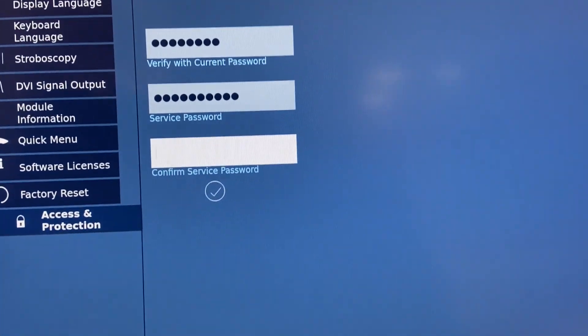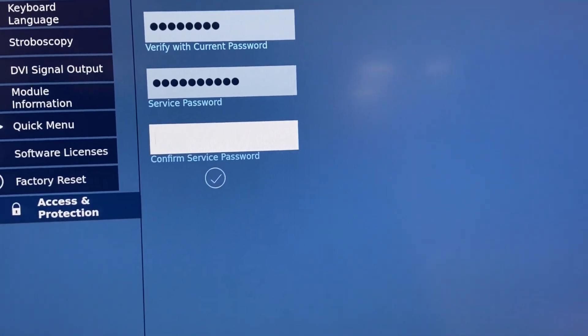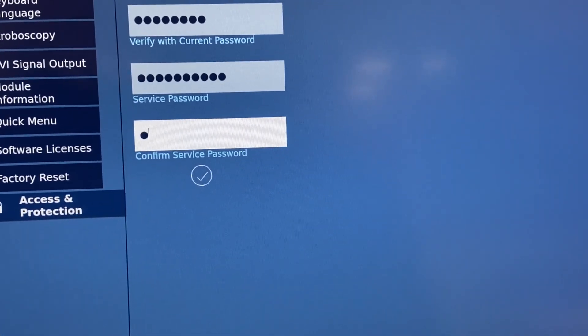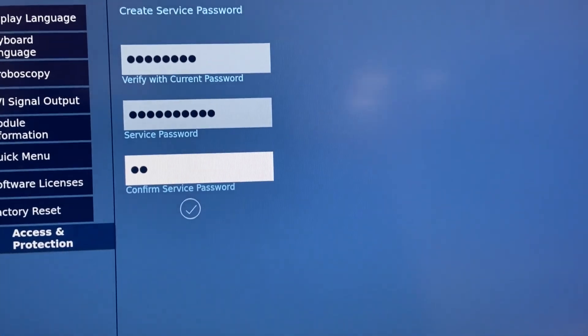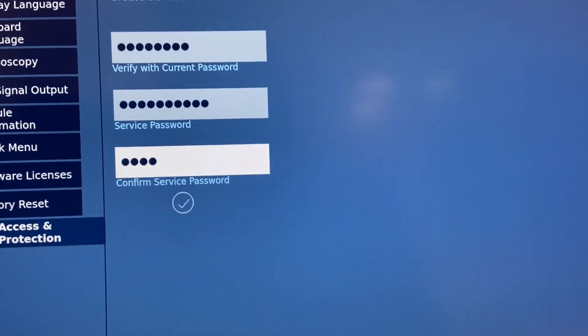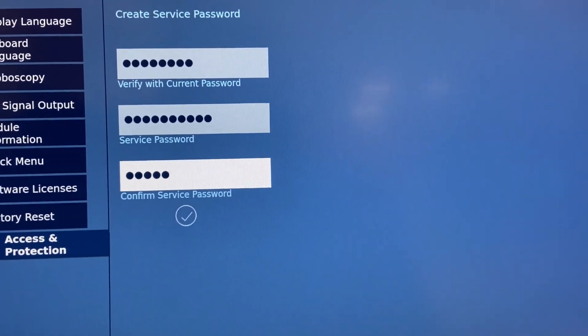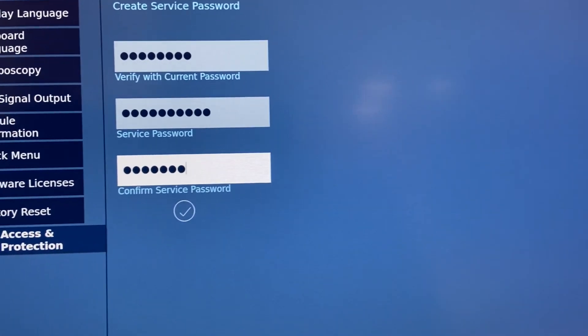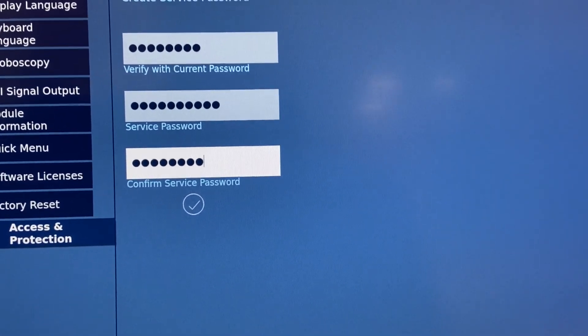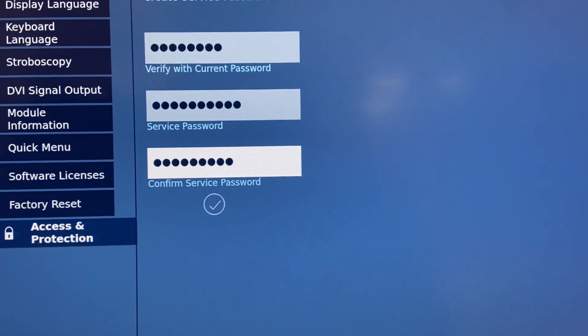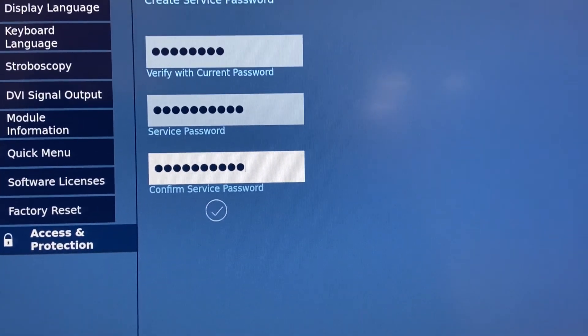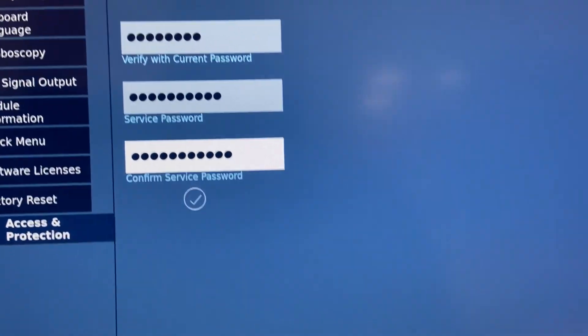Type it in again, K-A-R-L-S-T-O-R-Z-1, exclamation point.